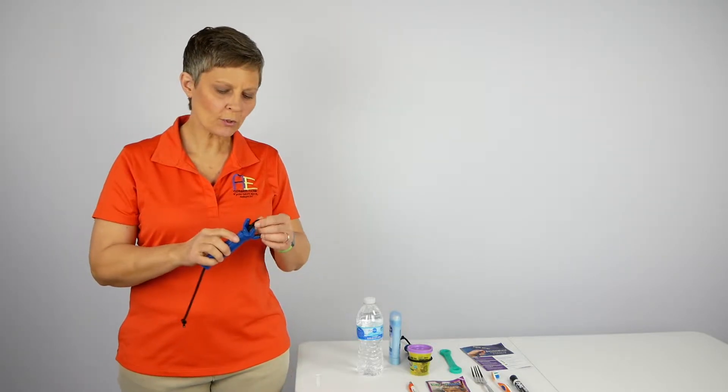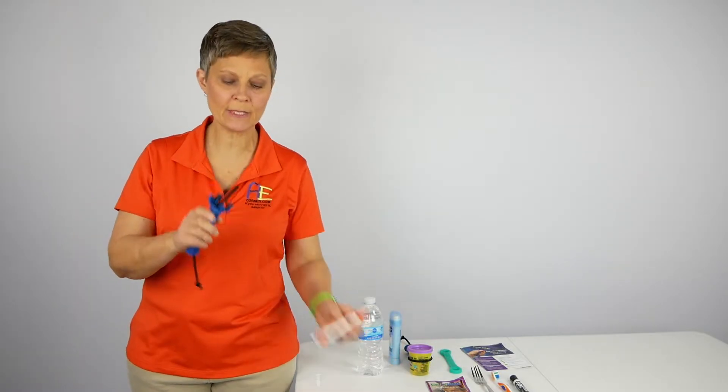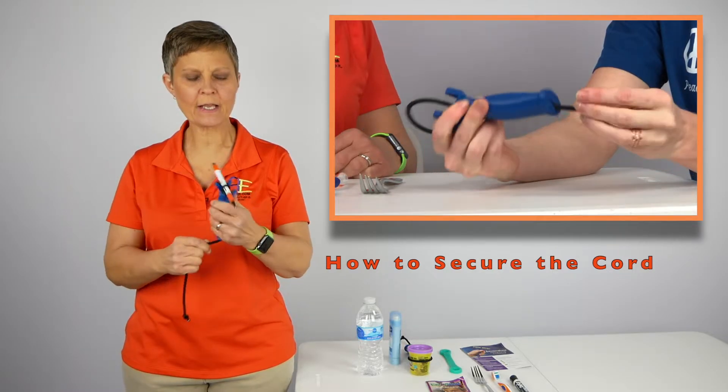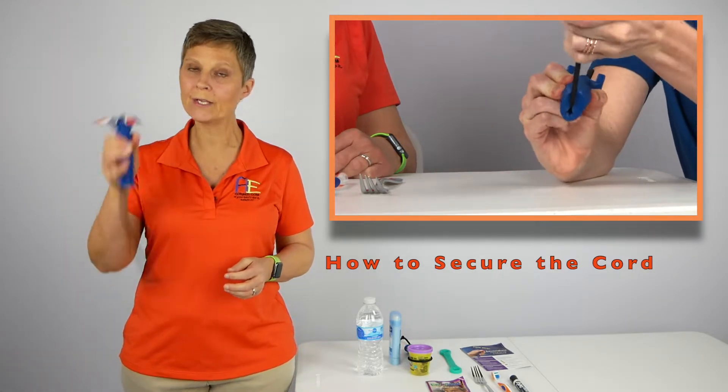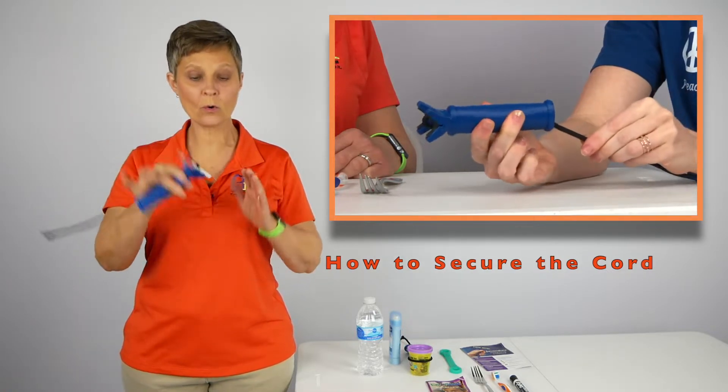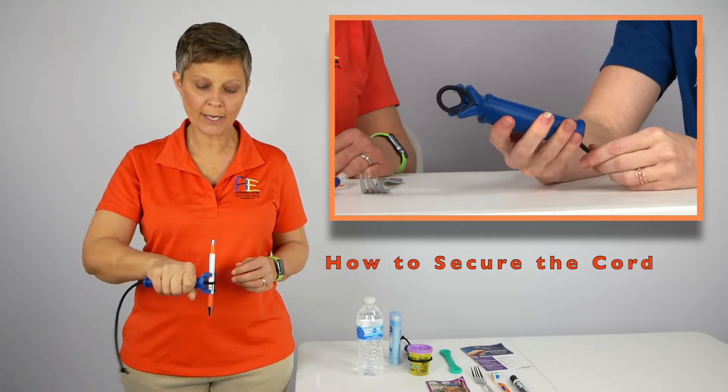You can use the Functional Hand in both a vertical and a horizontal orientation. For example, if I was using a marker on a whiteboard, I could use it in a vertical orientation. Or if I was using a pen, I could use it in a horizontal orientation.